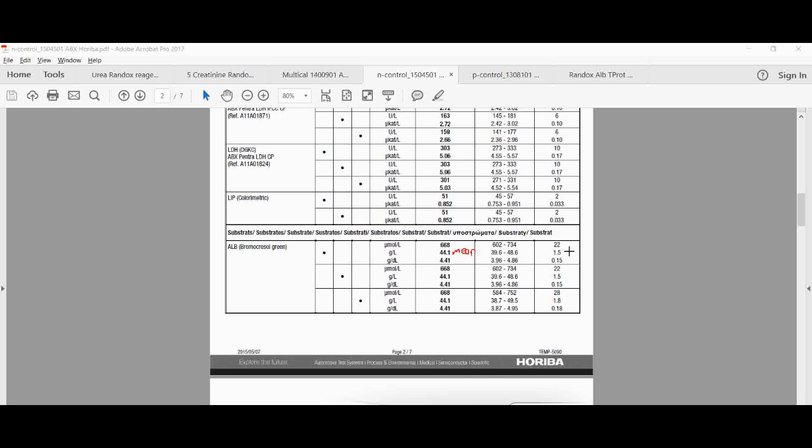If you want to go to 2 standard deviations, you multiply that by 2. If you want to go to 3 standard deviations, you multiply that by 3. Okay, so that's minus 1 standard deviation, and that is plus 1 standard deviation.